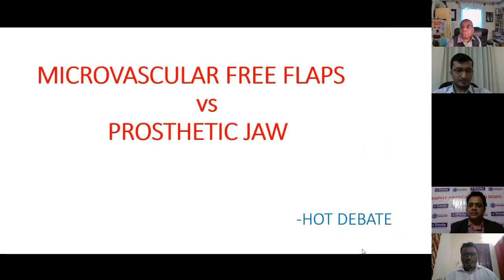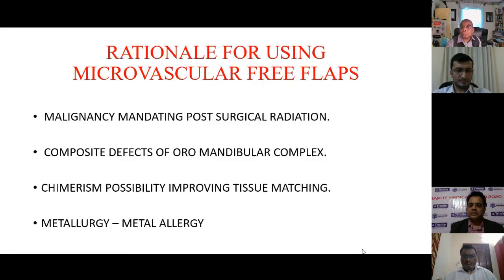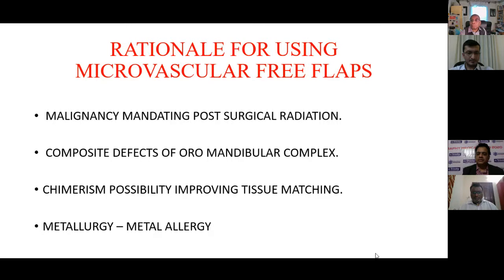So where do 3D implants stand today in maxillofacial surgery, from my perspective? Can it really make microvascular surgery obsolete in today's world? That's always a hot debate, and definitely there are merits for both. So where exactly do we want to use microvascular free flaps? Post radiation, or any malignancy mandating an extensive resection and needing post-surgical radiation, we would always prefer free flaps.